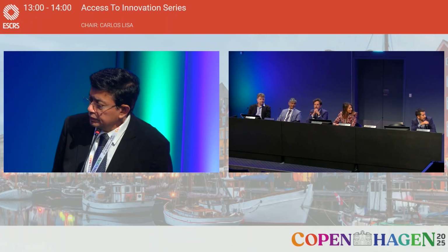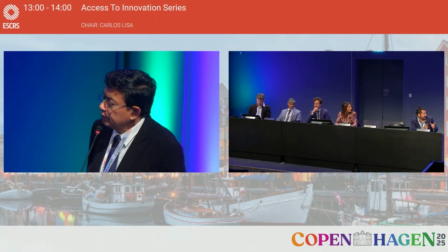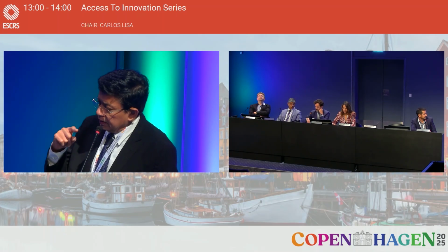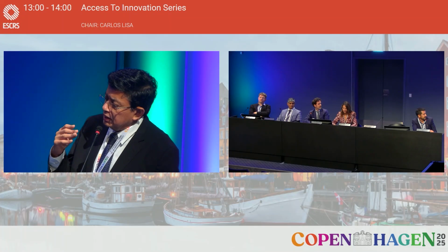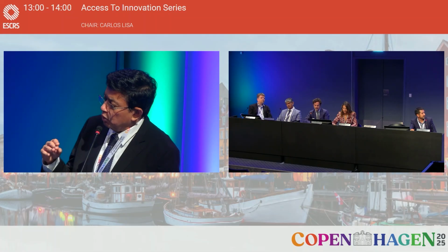You talk about the difference in the focus curve. It's almost flat. It's very good. But what really differentiates it from other EDOF platforms? The other EDOF platforms, as you see in the graphs that were projected, the ones we considered with the POC, as you can see, the drop off, those lenses also function quite well. As far as distance visual acuity is concerned, especially if you hit emmetropia, all of them seem to function quite well. It is only the intermediate and near vision that the difference becomes more obvious.